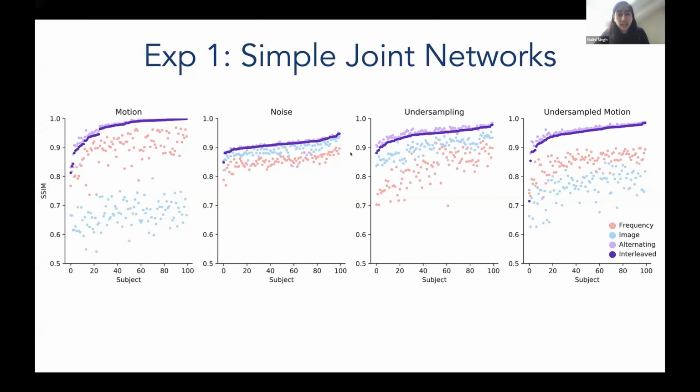The short answer is that it's definitely helpful to incorporate motion information, but there's challenges in incorporating devices which measure the motion inside of the MRI, which has a really strong magnet. And also, depending on the type of motion you have, a device like a camera might or might not be able to measure it. So, for example, some people are interested in fetal motion. If you just have a camera measuring the outside of the body, you won't be able to see that with a standard camera.